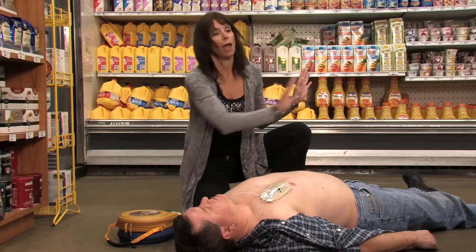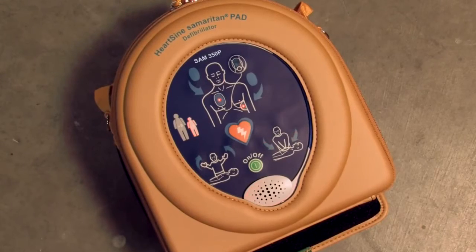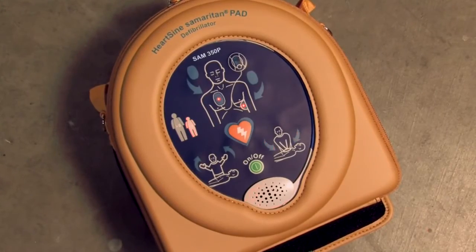Stand clear of patient. Press the orange shock button now. Shock delivered. Begin CPR. It is safe to touch the patient.